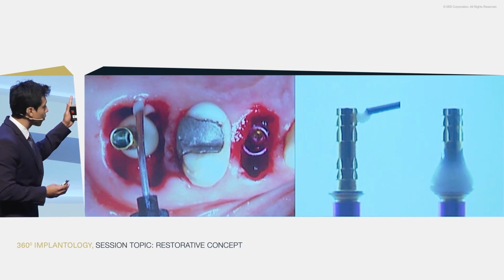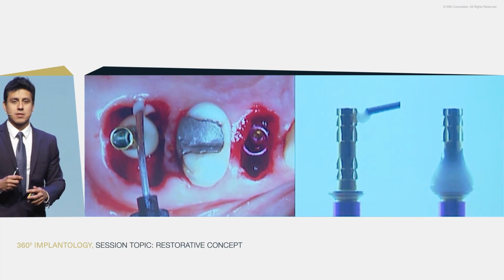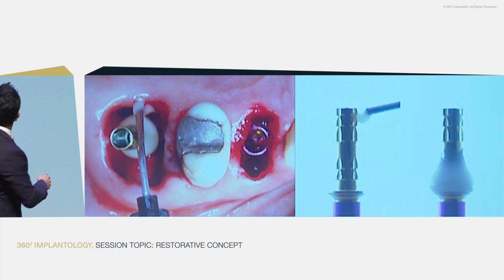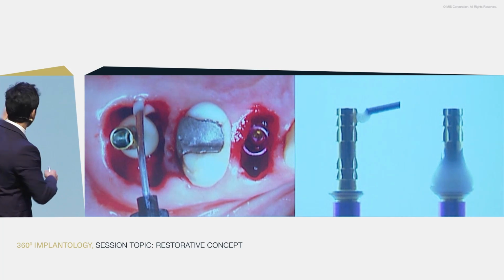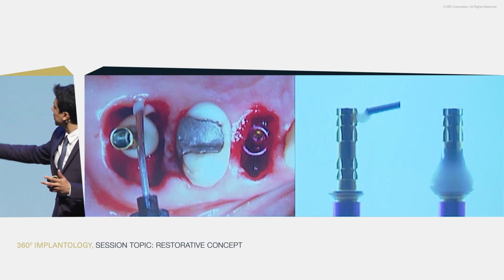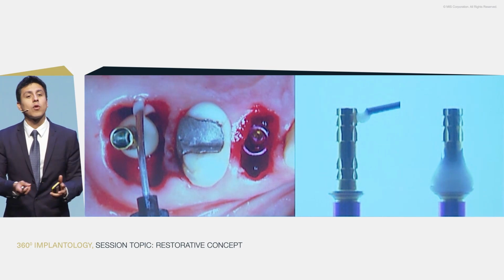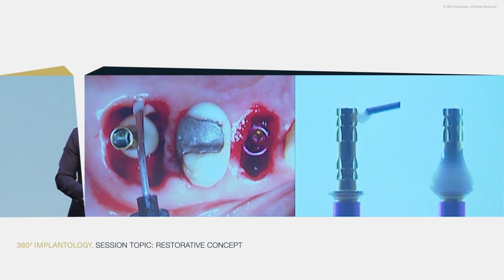We can have our provisional abutment, we can create a layer on top of this abutment, and we will place the provisional abutment with flowable composite on top of the implant. And after this, we have to create a layer copying the alveolus with flowable composite. But we know that we can now be in a danger zone.